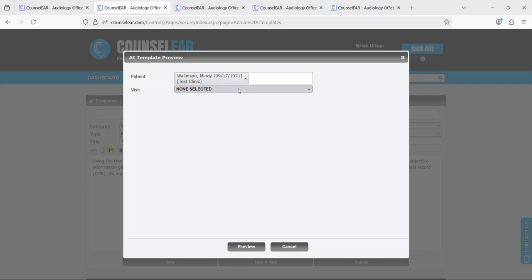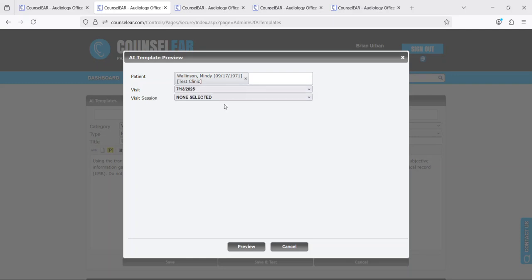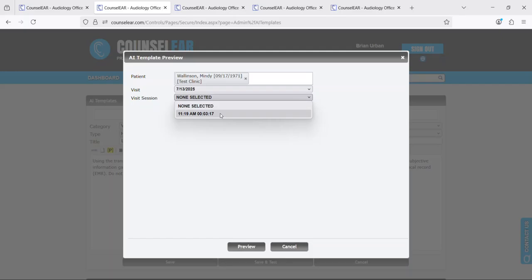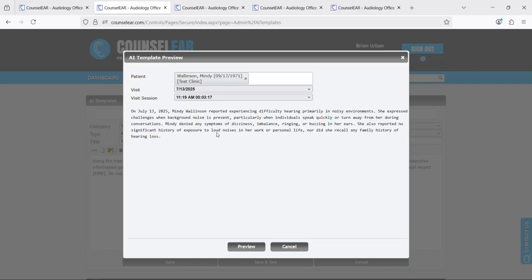So this might be a session that you just created on your own, doesn't have to be a real patient encounter where you say, okay we created this test, now I want to test it against that session. So there we go and now you can see a preview of what the template will do with the text, with the template that was added.